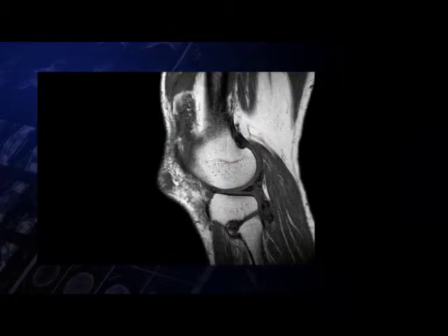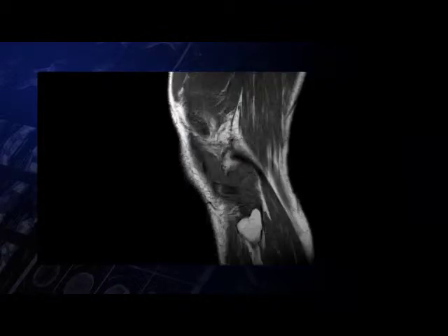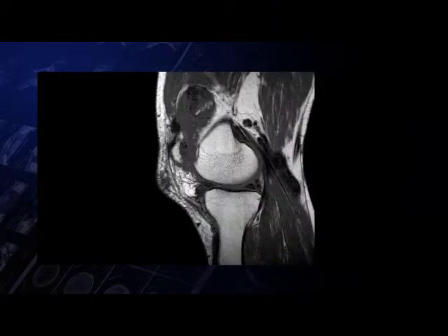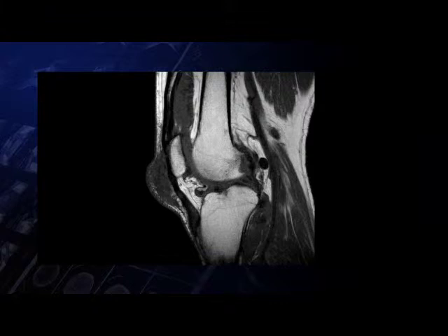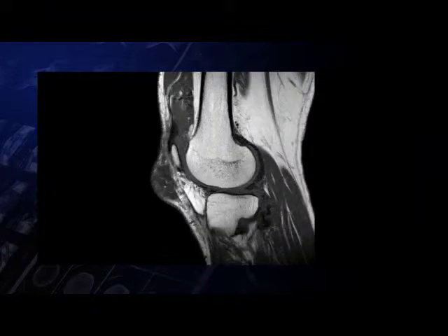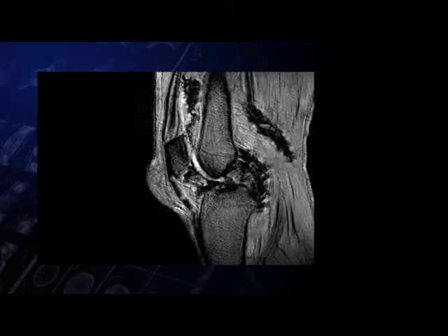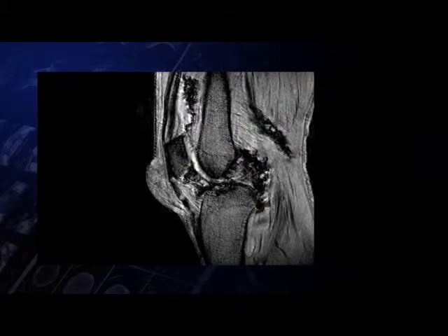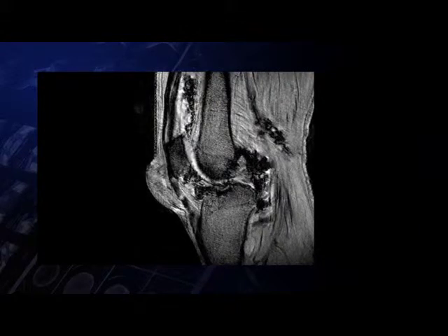Case 1: patient with a history of knee joint swelling. Images demonstrate diffuse synovial thickening with altered areas of signal intensity, predominantly hypointense on T1 and demonstrating areas of blooming on the gradient sequence.